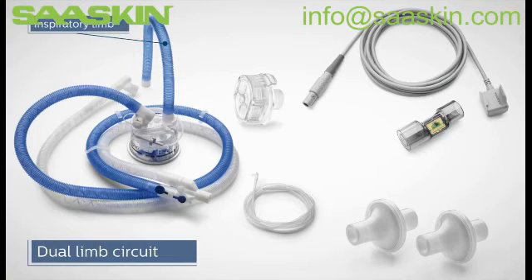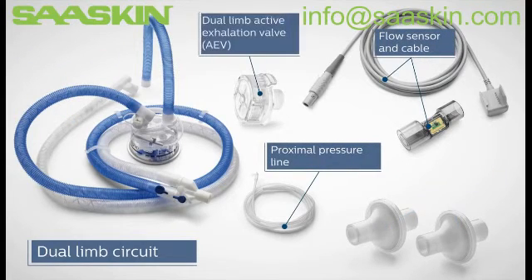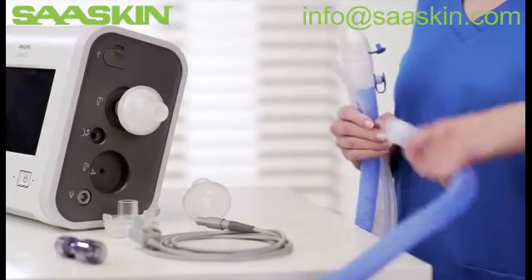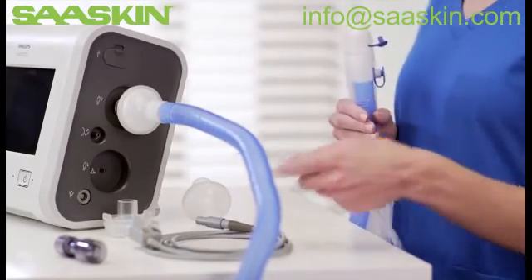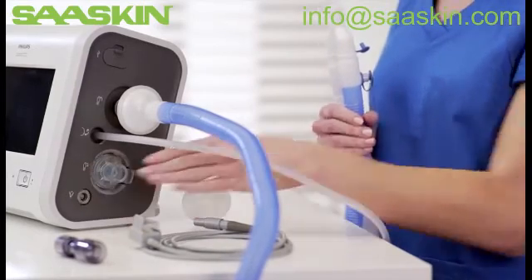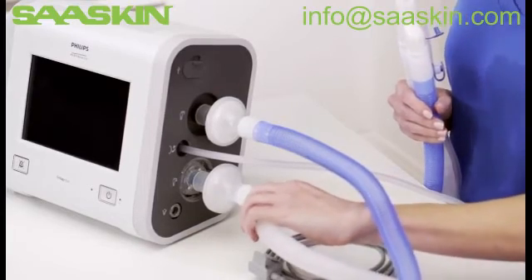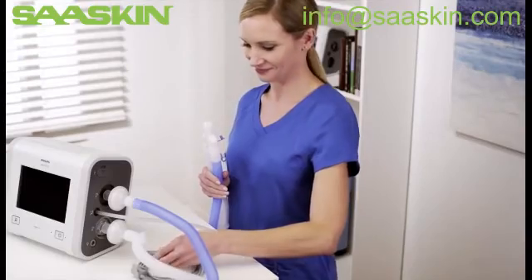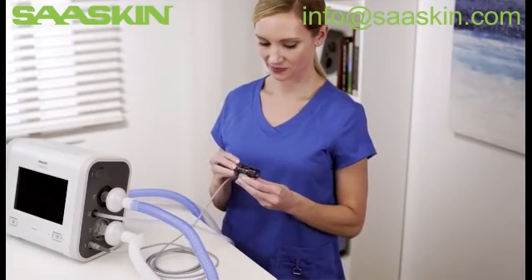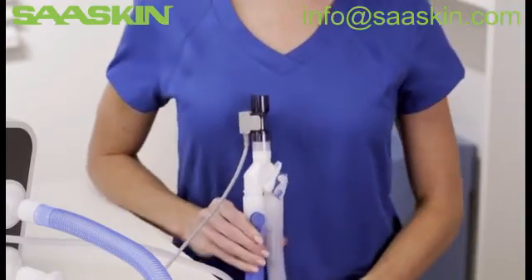The dual limb circuit has a blue inspiratory limb, a clear or white expiratory limb, two bacterial filters, a proximal pressure line, flow sensor with cable, and a dual limb active exhalation valve, referred to as the AEV. Connect the bacterial filter and blue colored limb to the inspiratory port. Then attach the proximal pressure line to the proximal pressure port. Insert the dual limb AEV into the exhalation valve connection until both sides click into place. Attach the bacterial filter end of the clear or white limb into the AEV. Attach the flow sensor cable into the connector. Next, attach the appropriate flow sensor — adult, pediatric, or infant — to the cable and clip shut. To complete the circuit, attach the flow sensor to the Y-shaped connector. The dual limb circuit is now complete.